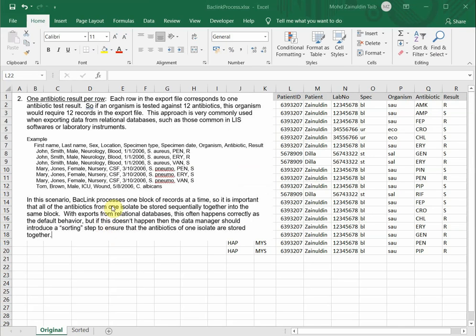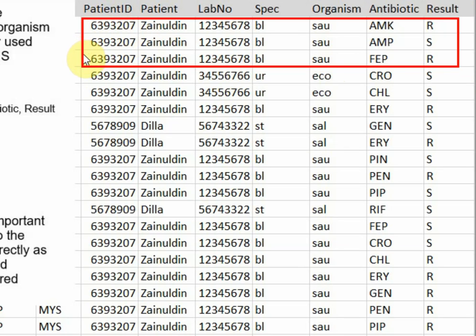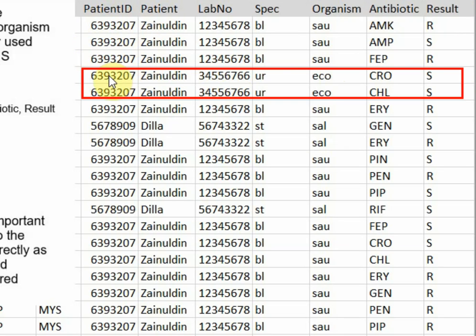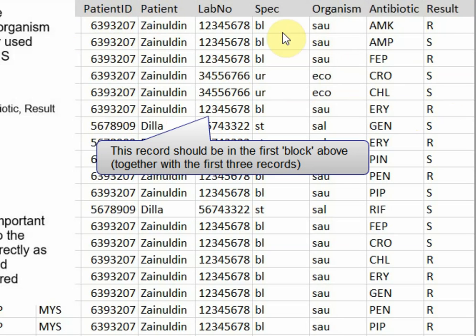But what does Backlink consider as a block of records? I give you a sample here to explain. You can see here there are three records, the same record with patient ID, lab number and organisms. These three records are considered as one block, and converted as one isolate. And this is another isolate, urine, E. coli, another isolate. But when it comes to the next record, even though it's actually the same record, it's not sorted, it's not within the same block as the first block above, and it's considered another record, another isolate.